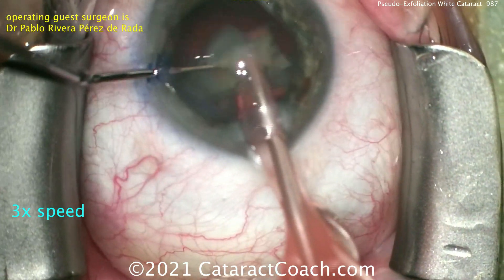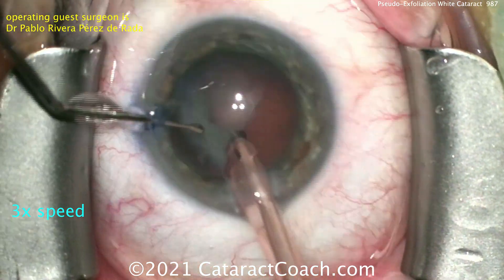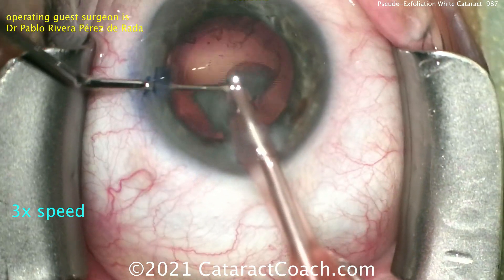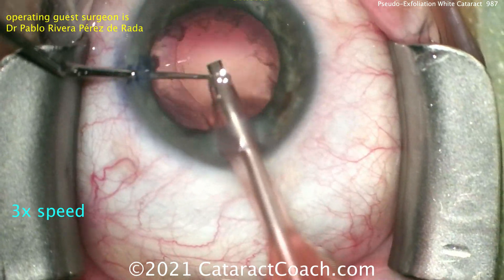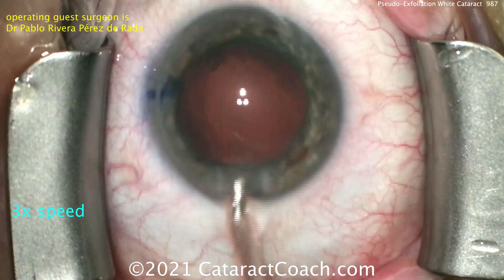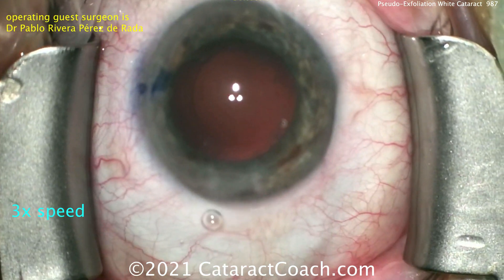Now, this is the pink sleeve on the phaco tip, which is usually about a 2.2 to 2.4 millimeter incision, which should be good. It looks like the surgeon is sitting temporally here. There's the last piece. The chopper goes in the protective position — or second instrument in the protective position — and we can get the last few fragments out.